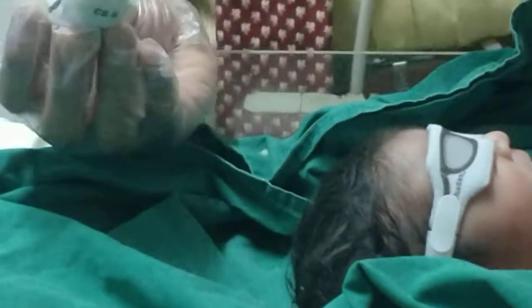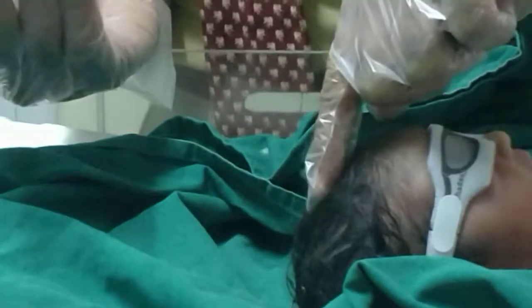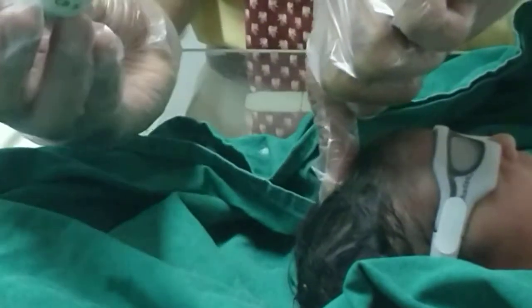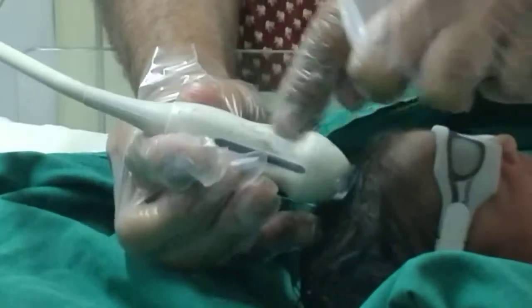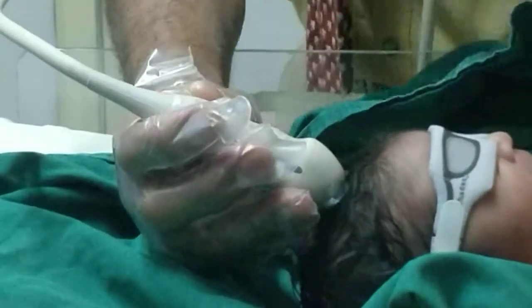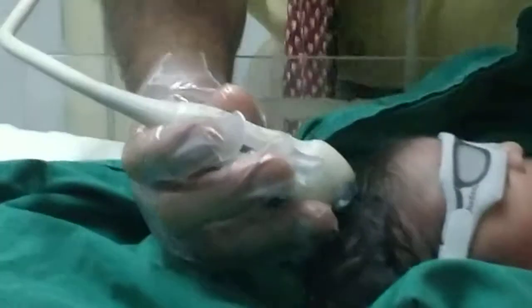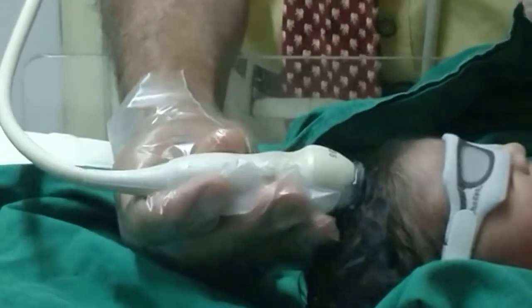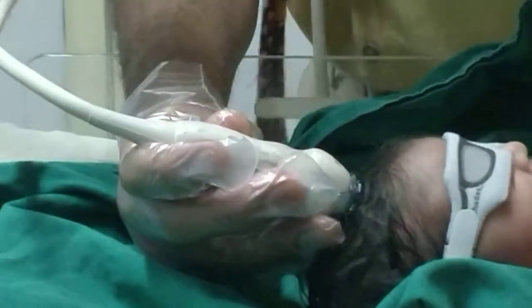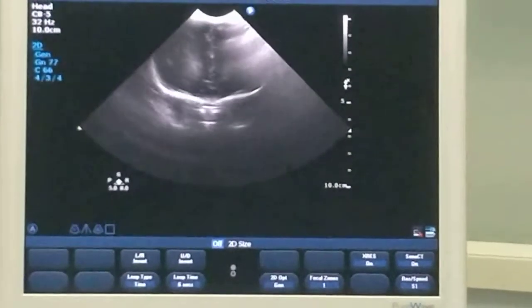There are two important views we look at. One is the coronal view. Here, this is the anterior fontanel, and I am using this anterior fontanel to accommodate the transducer. This is the curvilinear transducer with the marker facing to the right. In the coronal view, to get the images, I have to scan from anterior to posterior. This is the anterior-most portion of the brain.